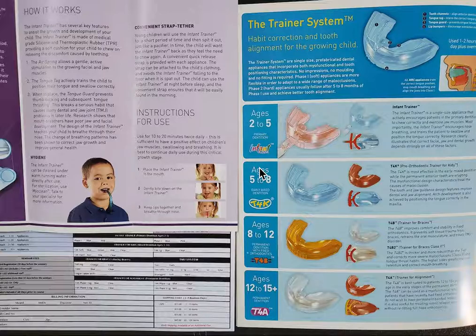So where I like it the most would be more the T4K, which is age 5 to 8. Okay, so that's a pre-orthodontic trainer for kids. This is the one that I use the most. Again, there's a soft and a hard. Start with the soft, move on to the hard. I would definitely buy 2 appliances. It's effective in the early mixed dentition while the permanent anterior teeth are erupting.